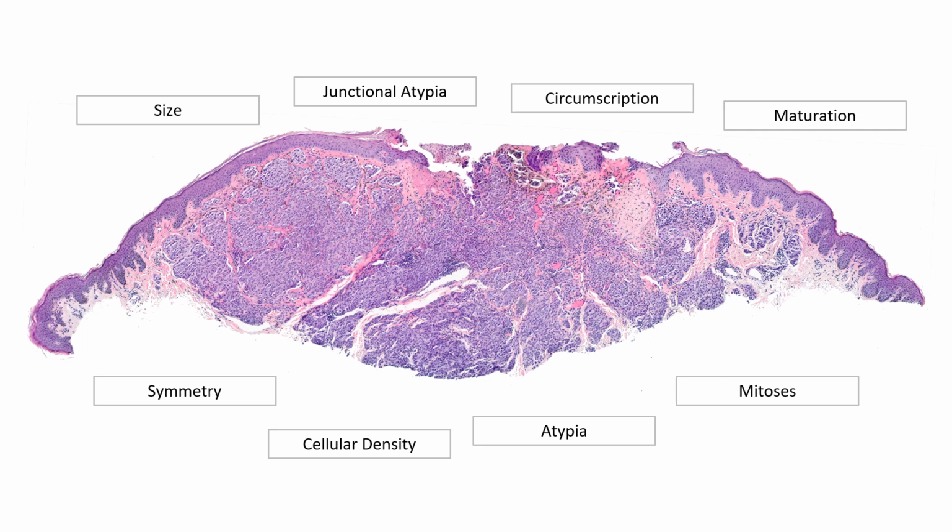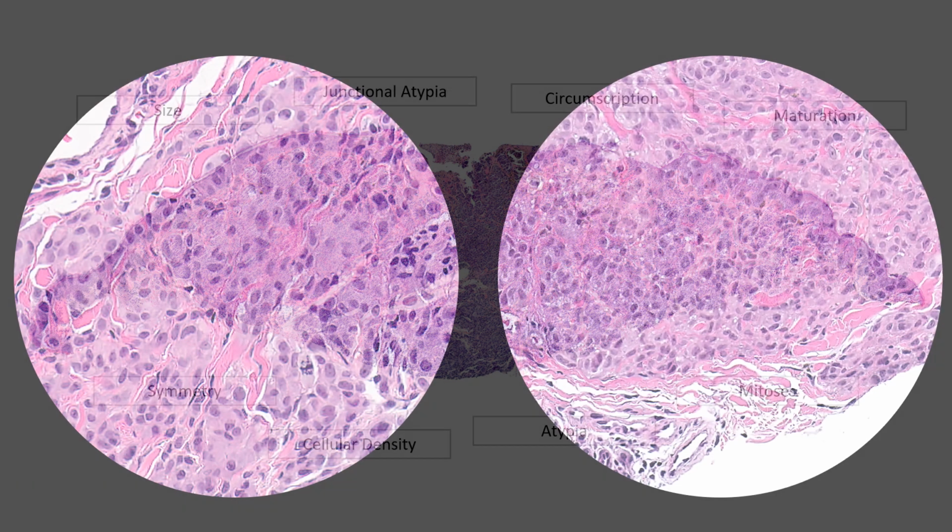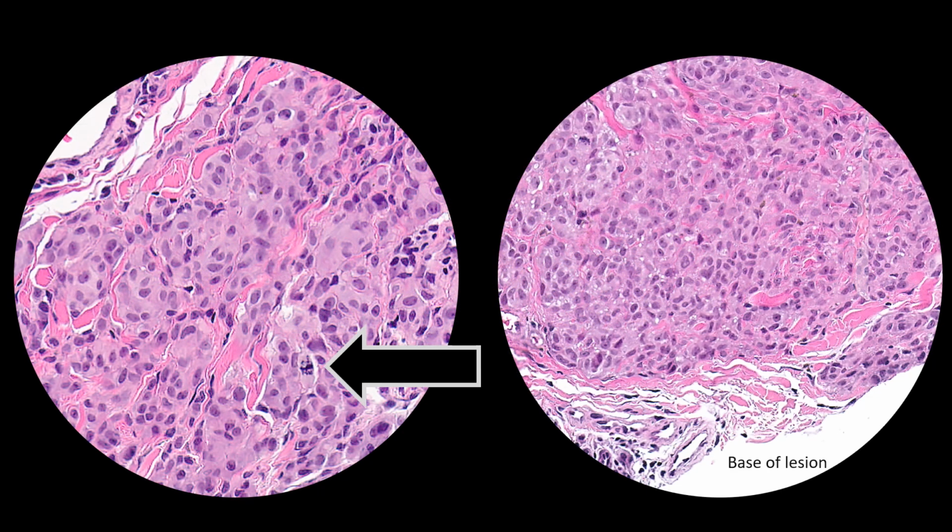And as a result, for most dermatopathologists who examine this case, the diagnosis ultimately depends largely on the detection of mitotic figures within dermal melanocytes, and those were somewhat difficult to find. But in fact, there are 3 dermal mitoses in this section, one really obvious one near the junction, and 2 others that were clustered within a single nest located near the base of the lesion.